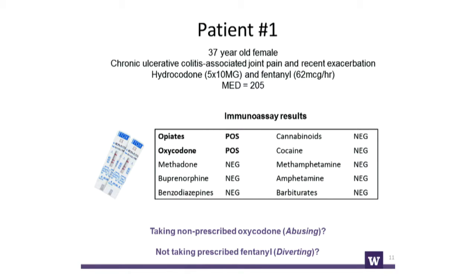As is somewhat surprising for big government legislation, while they passed this legislation, they didn't give any guidance on how to actually track opioid usage or do this compliance monitoring. So how do we do that in the lab? So the best way to go through it, I thought, would be to start with some case examples.